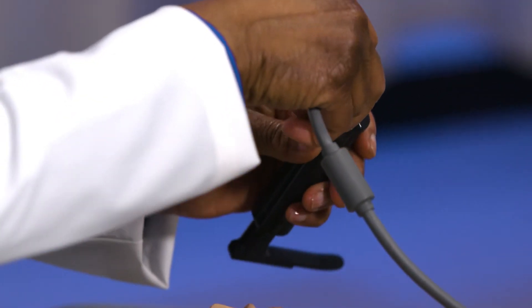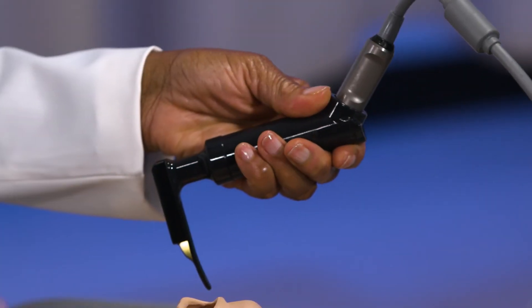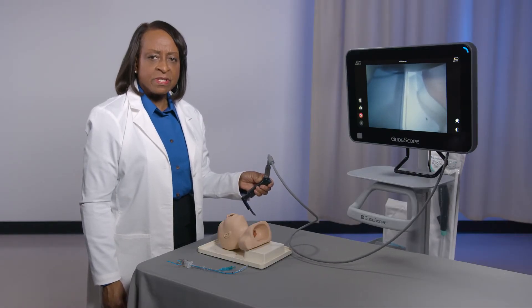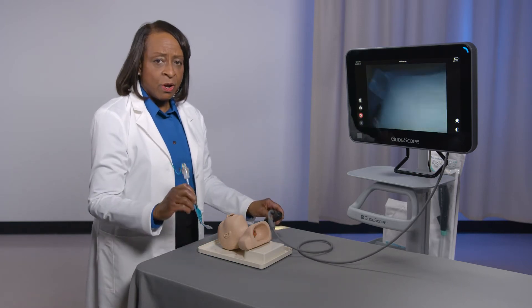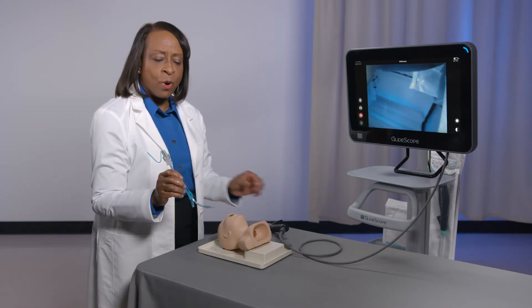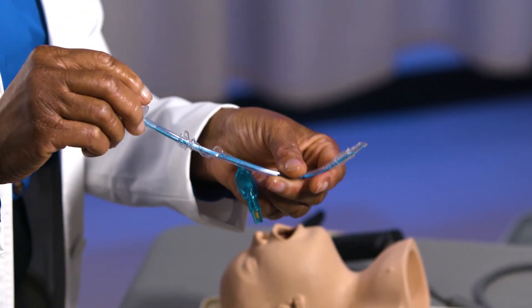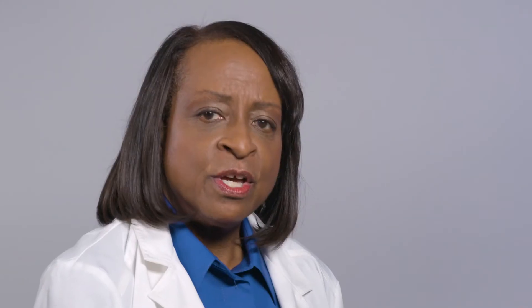With a Miller video laryngoscope, the technique is the same as with a non-video straight blade laryngoscope. When using a Miller video laryngoscope, I will typically use an endotracheal tube with a malleable stylet, although it may not be required in all cases. A stylet simply adds stability to the endotracheal tube throughout the intubation to help you optimize the chance of intubation success with the first attempt, especially in rapid sequence intubation.